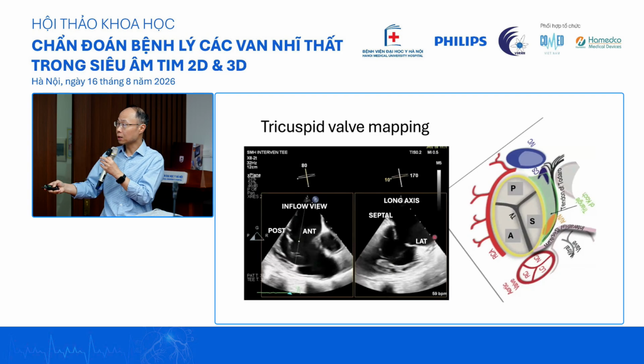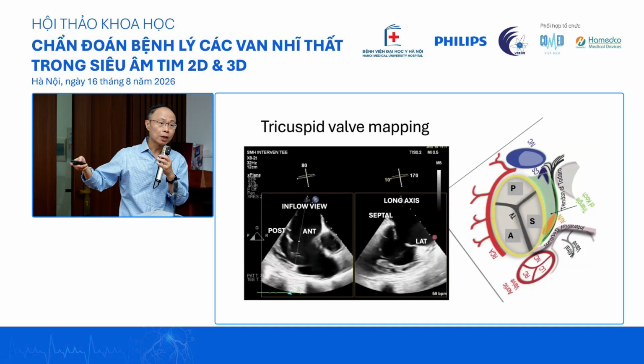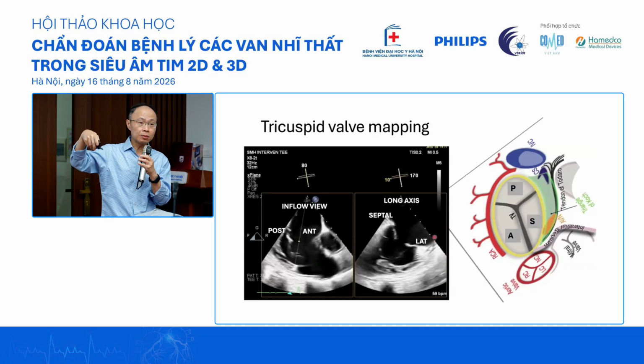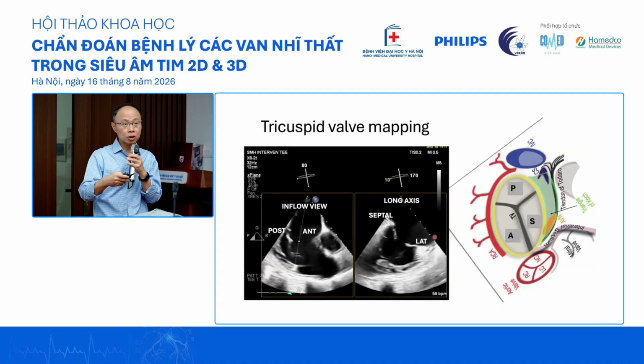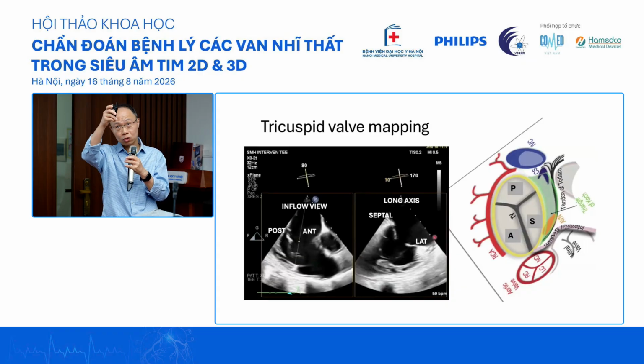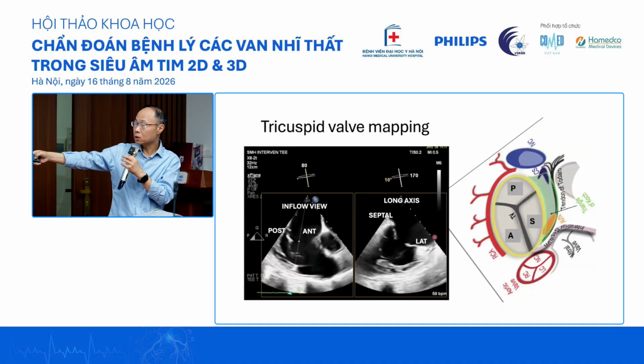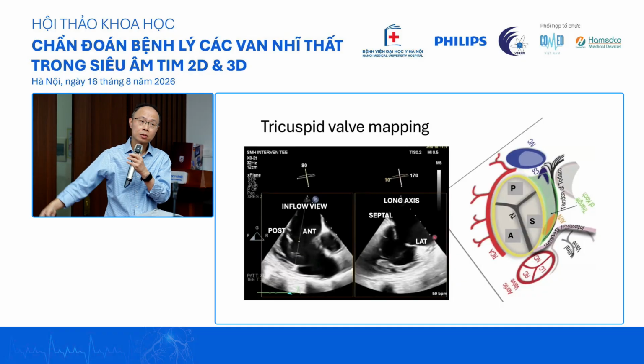So number one is that this is a transesophageal. You've got to go a little bit deep. So this is a deep esophageal, not yet transgastric view. If you do your mid esophageal view, like just now you saw on the mitral valve, you get your apical four-chamber, sort of a four-chamber view. If you push a little bit down, you can get over here. So this is the inflow view. This is usually about 90 degrees.